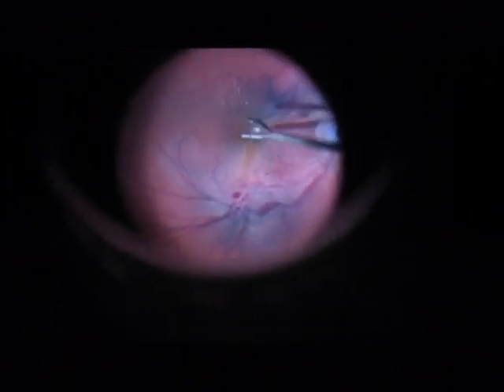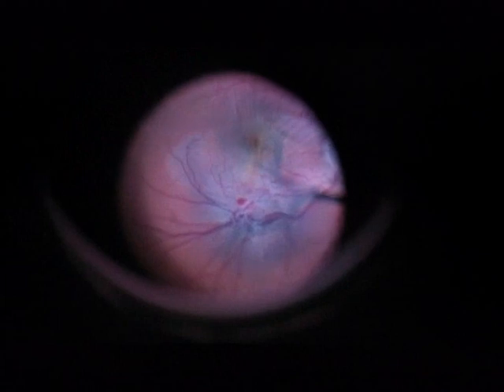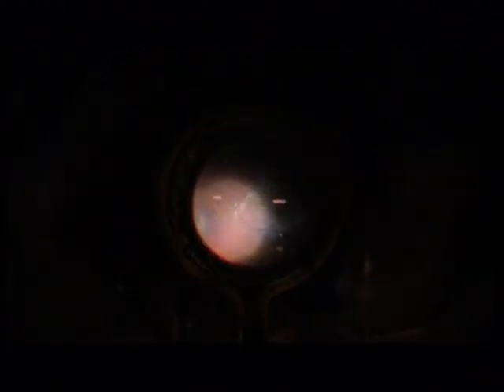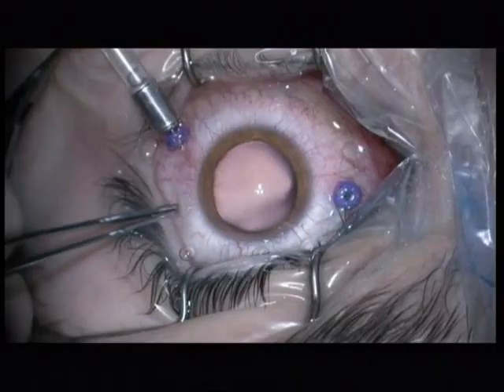Just have another look at the superior arcade — you see that there is no membrane left. This is an interesting point for the follow-up; of course in the follow-up we will find a surprise. I also examined the periphery and found no rupture which could explain this membrane. So there is no membrane left and we have an idiopathic membrane.